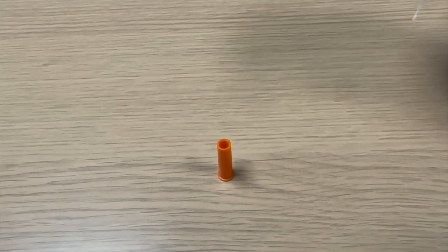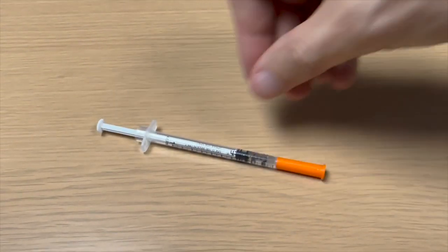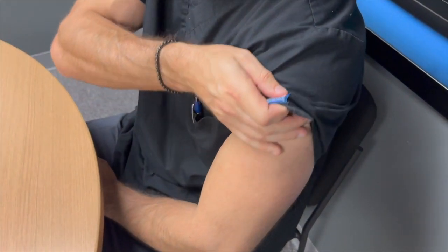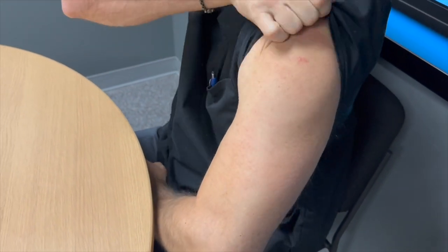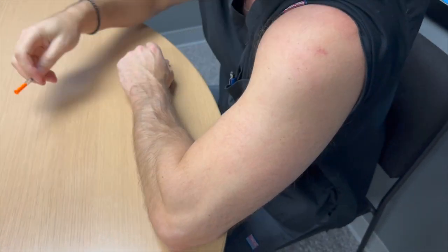Next, cap the needle carefully to prevent contamination and sit it in front of a table. Roll up a sleeve and place the arm on the table with a 90 degree bend, ensuring the elbow is rested to release tension from the lateral deltoid muscle.